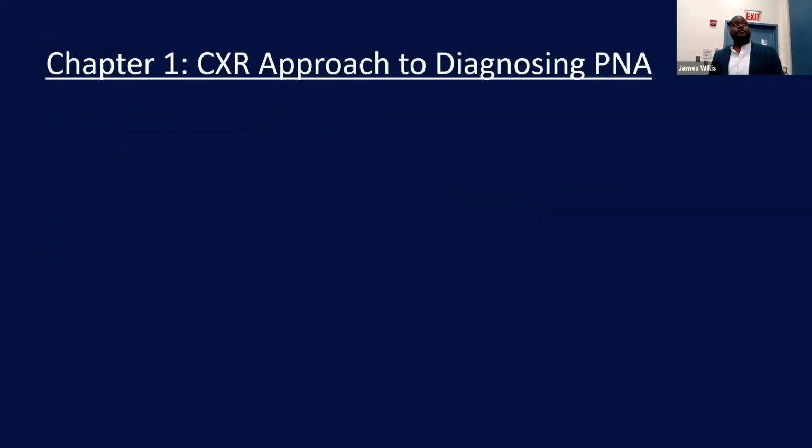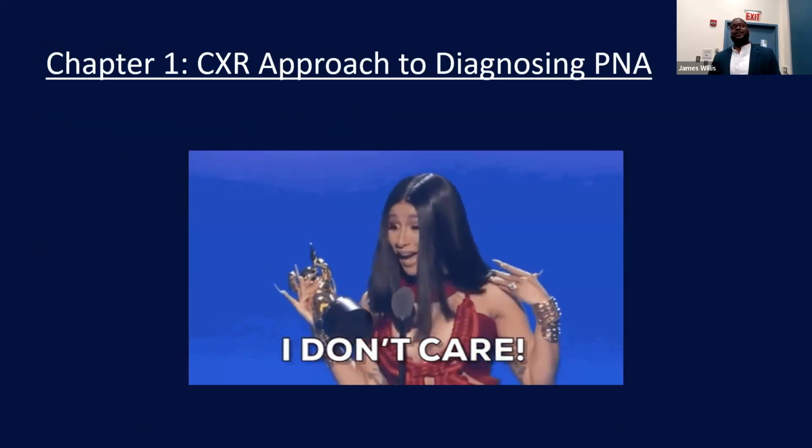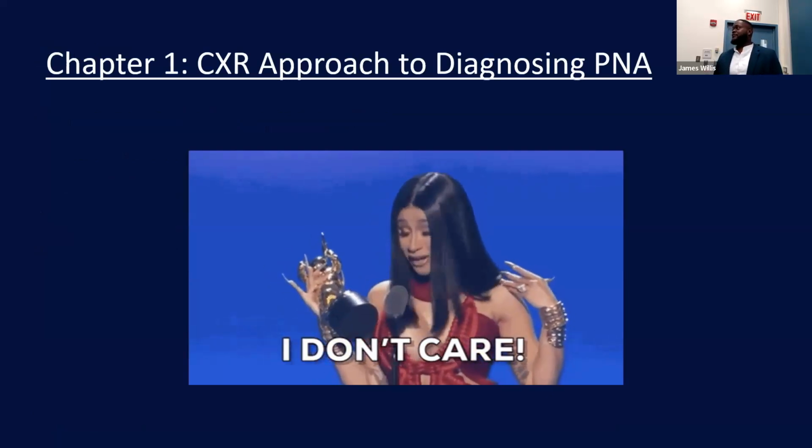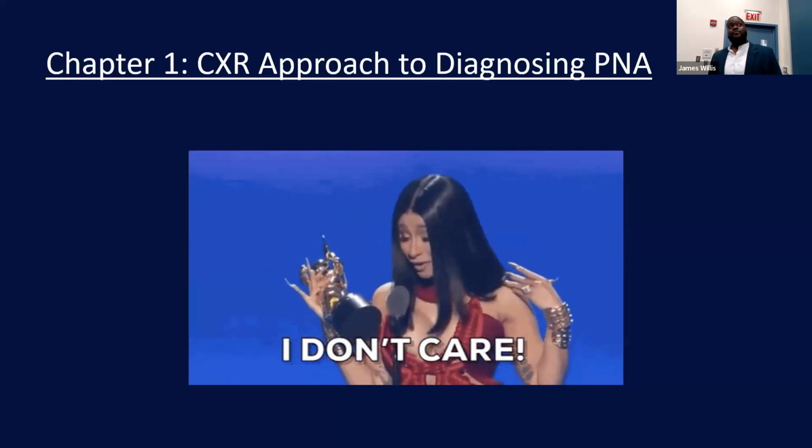So chapter 1, the chest X-ray approach to diagnosing pneumonia. Now you all are probably wondering, why exactly are we using a chest X-ray to diagnose a clinical diagnosis of pneumonia? We also have radiologists. I don't care, right? This is a little joke right now. This is going to be a very interactive presentation. So let's lighten up a bit.